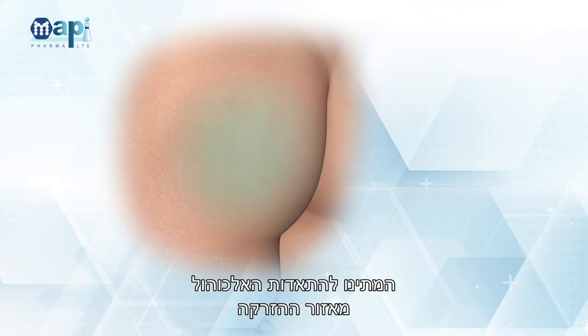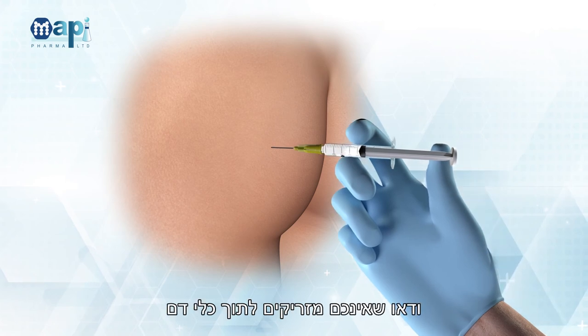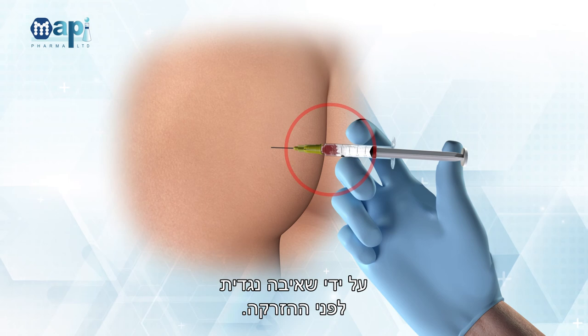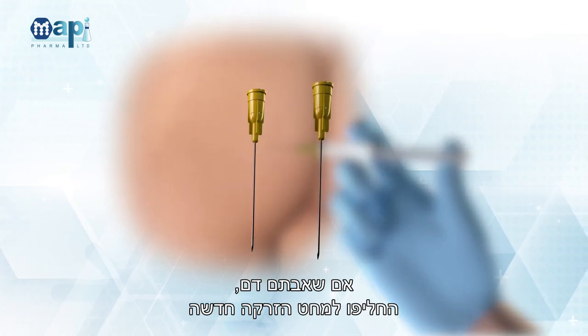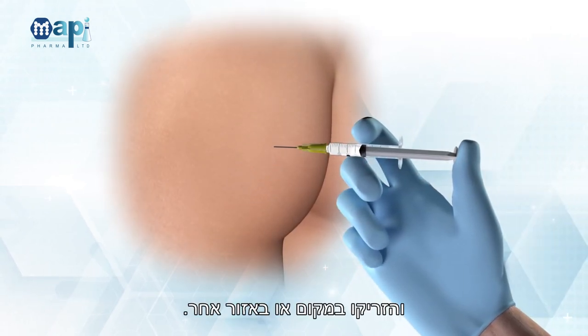Wait for the alcohol to evaporate from the injection site and insert the needle. Make sure you are not injecting into a blood vessel by performing negative aspiration before the injection. If blood is drawn, change to a new 20 Gauge injection needle and change location or injection site.